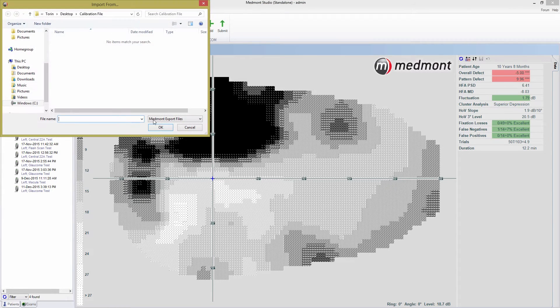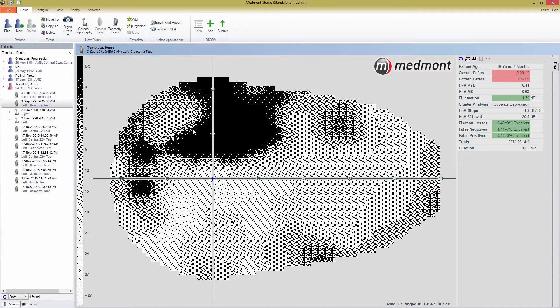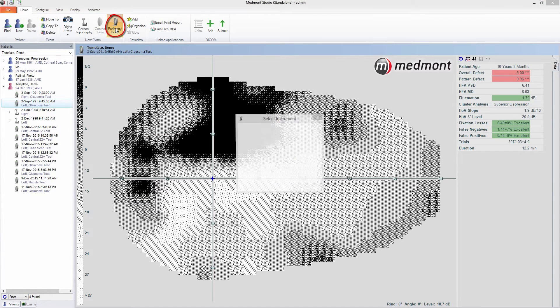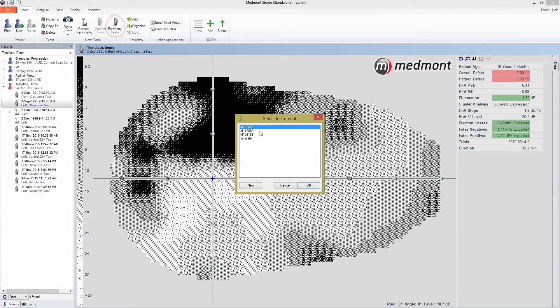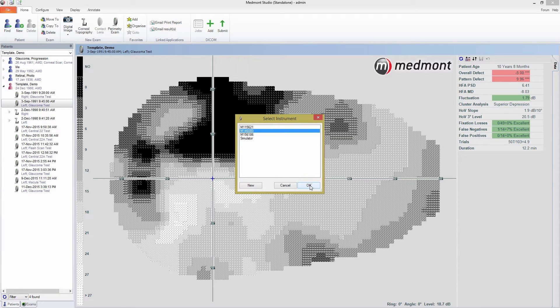When you're ready, press the Perimetry exam button. This gives you the option to select from any perimeters you have installed. If you already selected a default, this window will be skipped and the Perimetry exam window will open immediately. I'm going to select the perimeter I have attached and press OK.